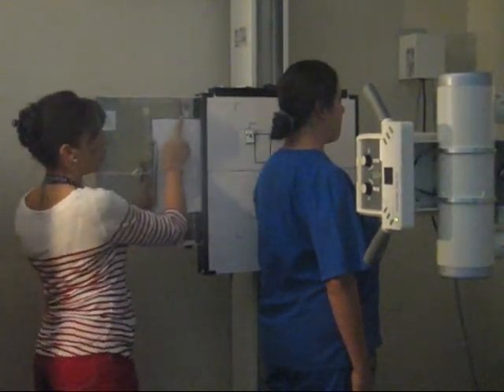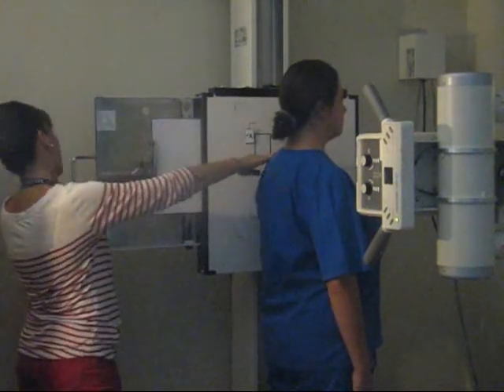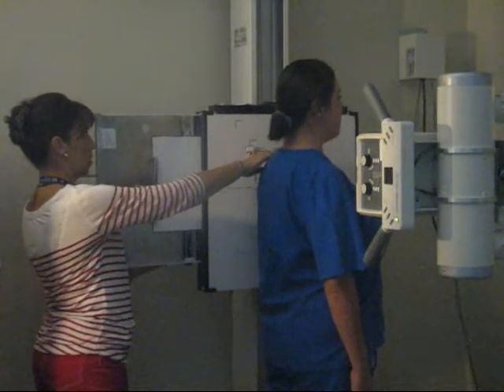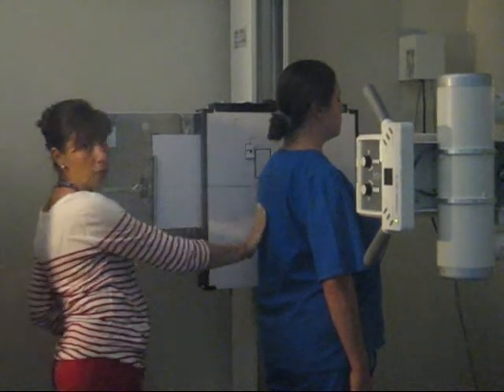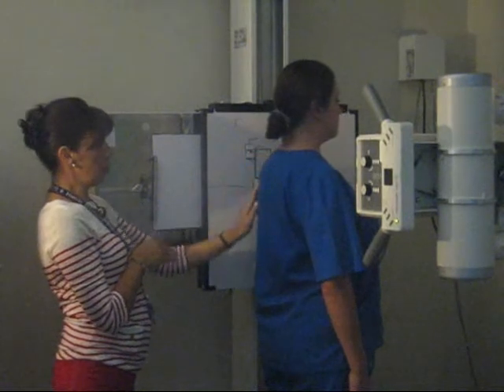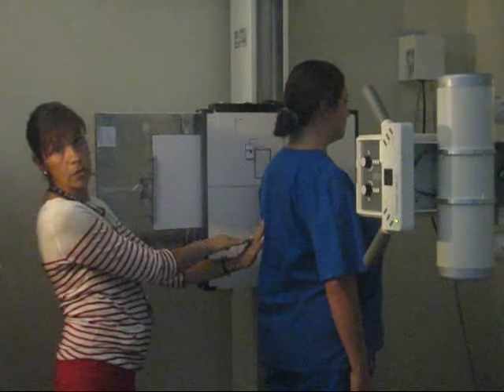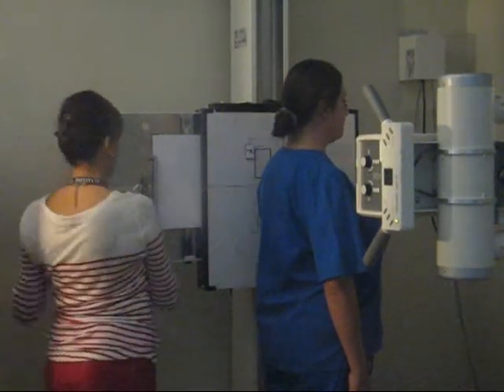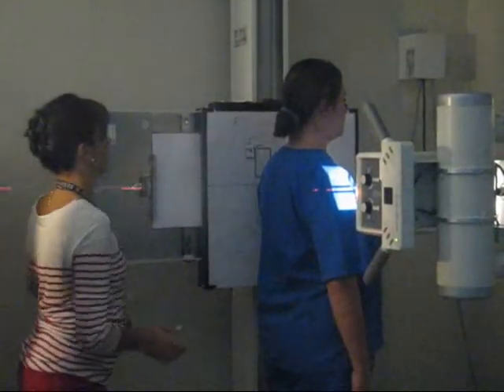You're going to want the top of your IR to be about 1.5 to 2 inches above the shoulder. So I can bring this down a little now to there, okay? And if you are not sure if you got this without cutting anything, just bring your hand down to the end of the scapula in the patient and make sure that your cassette is within that area, which it is in this case, okay? So your CR is centered to the cassette.